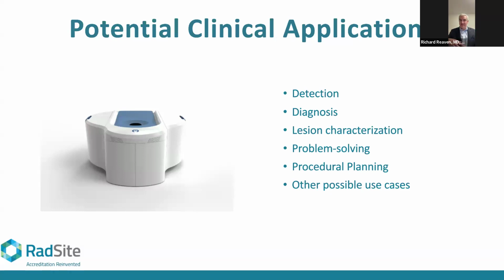In fact, I've shown a bunch of my colleagues some of the great images that we've done, and a lot of the images we are able to detect and identify are better than the ones that we see in the textbook for breast MRI ruptured implants. There's a sign called the linguini sign we talk about all the time in the breast MRI literature. I have a number of cases that I show my colleagues, and this looks like a better linguini sign than we're seeing on a breast MRI. So we're able to identify these implant ruptures extremely well in this population, and for the implant population, the clinical applications are spectacular.